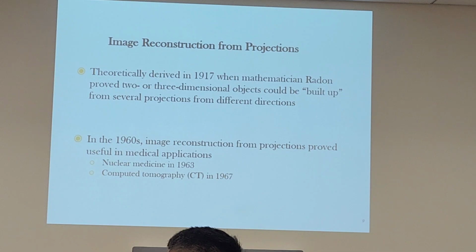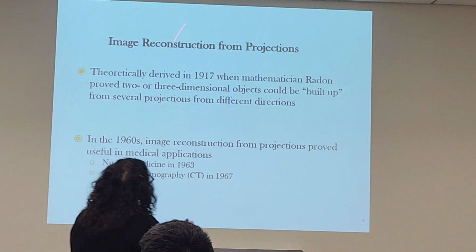Does everybody understand what data acquisition is now? Perfect. I can only reconstruct the data that was acquired. So start off with axial and then reconstruct into whatever I want it to be. So that's going to be eventually what your protocols are. What we're gaining right now is when it all started.